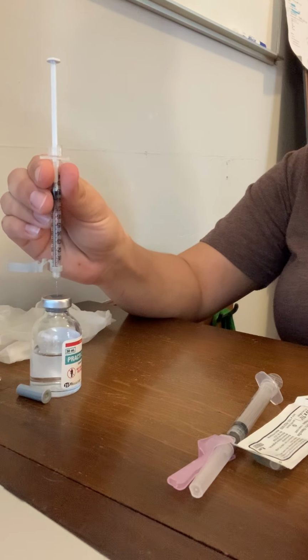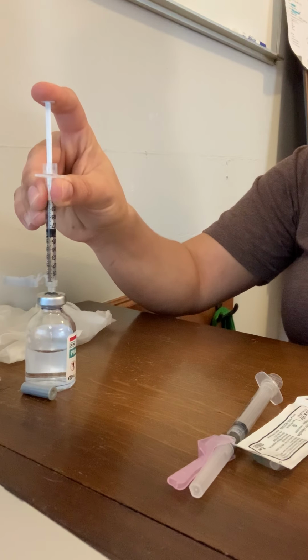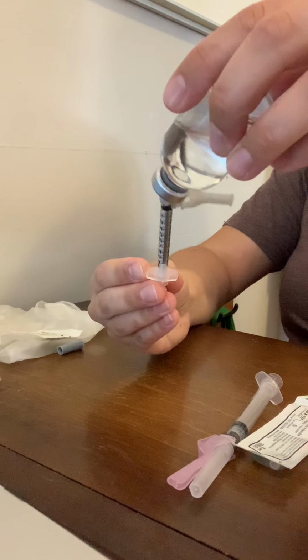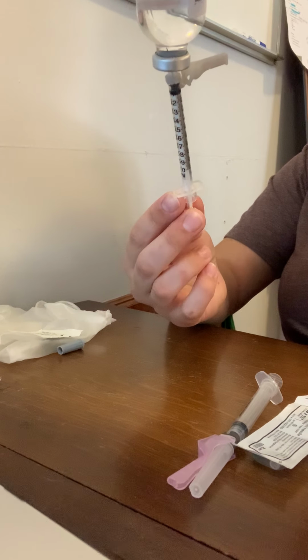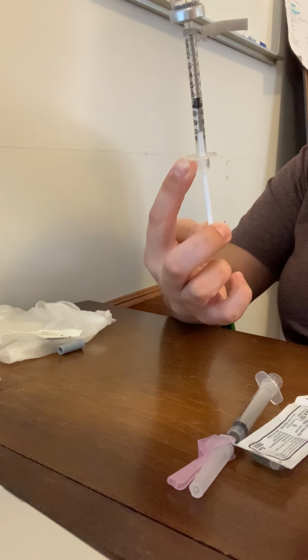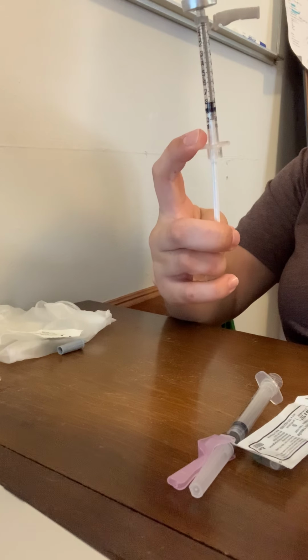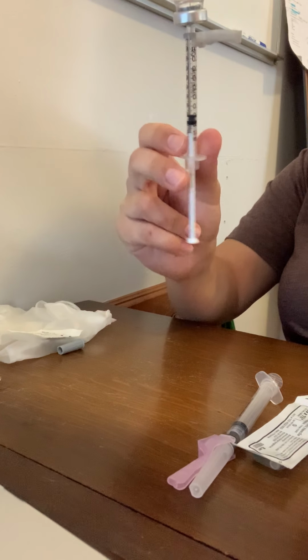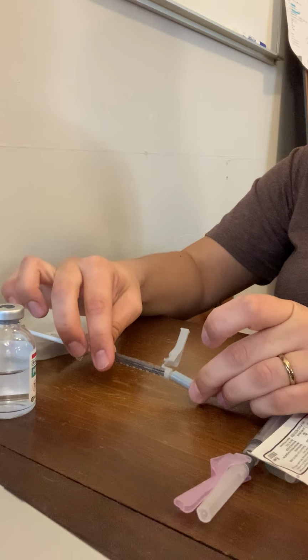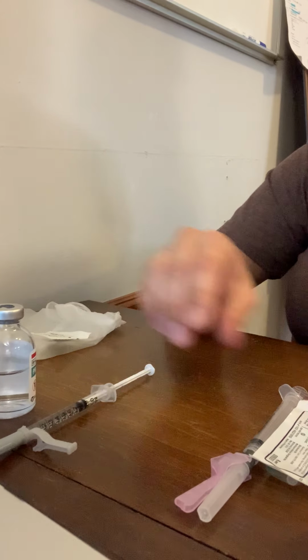I will inject the air to pressurize, and then I'm going to draw up 0.8. Recap, and that is my heparin.